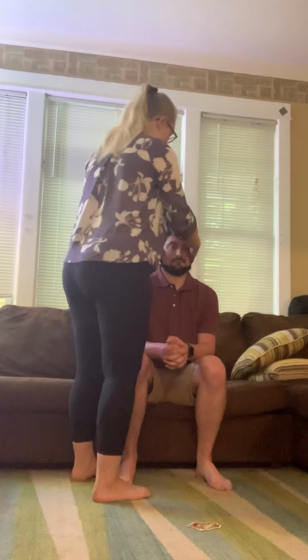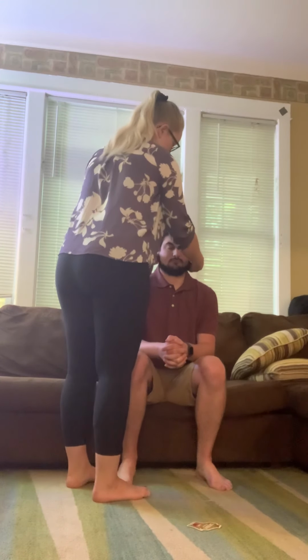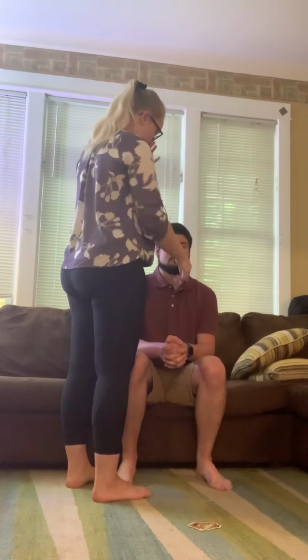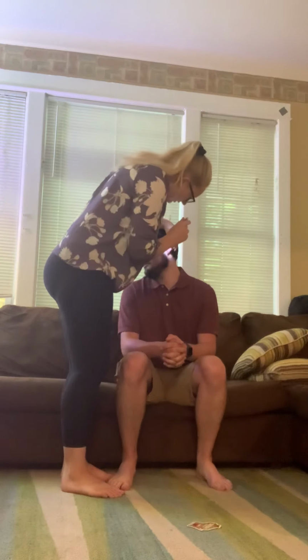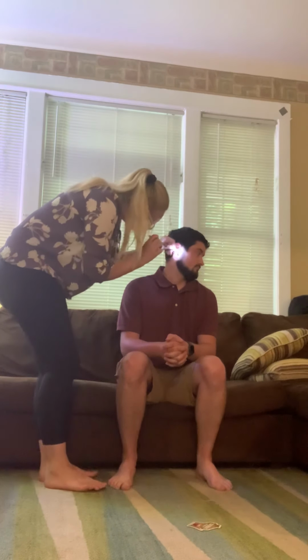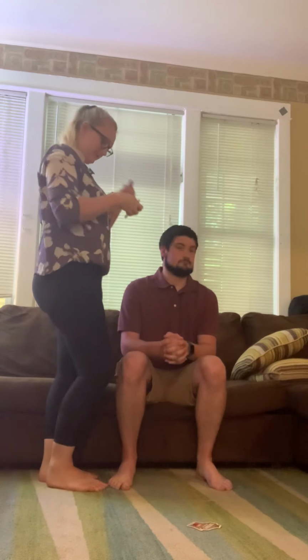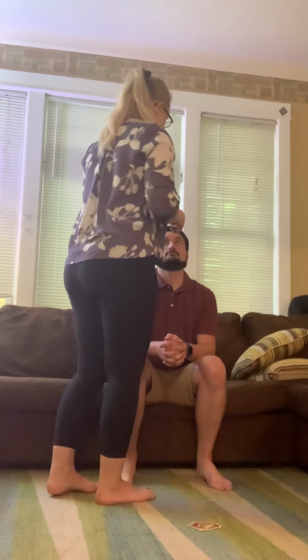And the next thing I'm going to check is your pinna, which is the outside of your ears, and I'm just feeling for any bumps. At this time, I'll have you turn your head towards me, and I'll take a look inside your ears. For an adult, we pull up and back. And the other one. Up and out. Good. So in your ears, I'm looking for any drainage or swelling. Okay, chin up just a little.